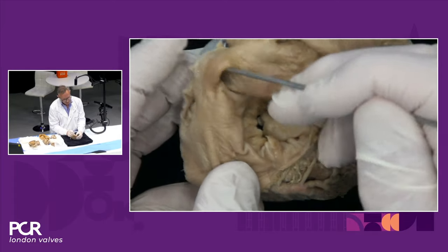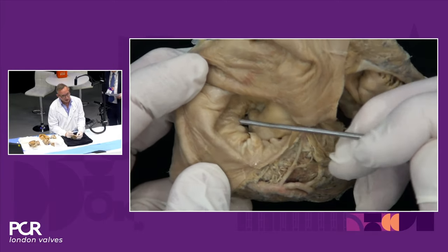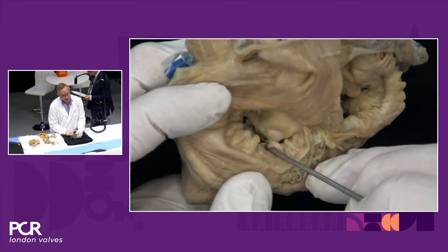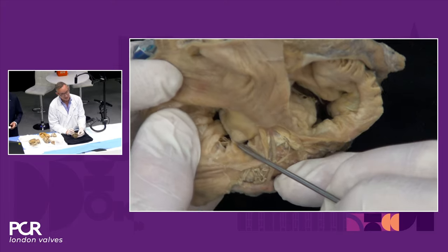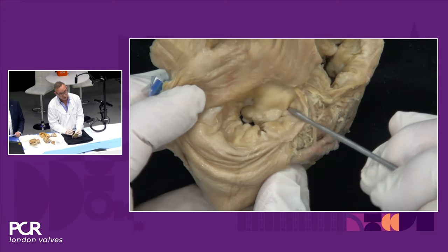As I've got it oriented, this is the left atrial appendage at the top. This would be P1, P2, and then P3. As you'll see, there are folds between the leaflets. And you can see here, I just want to focus on that, this is a so-called cleft between P2 and P3. You can see there's leaflet tissue underneath there. This would be the anterior leaflet on the top.